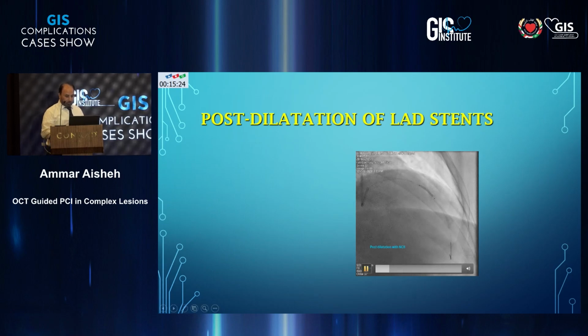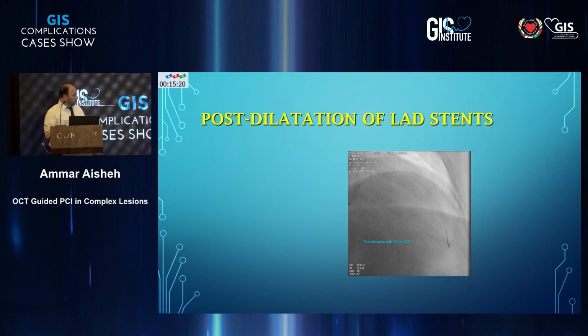So I think that, as Dr. Mohanad mentioned, because the lesion usually is a subtotal occlusion, the contrast doesn't reach the distal area, so you undersize. There is a tip here: you can inject from the side arm during the pullback, so you can get the proper sizing in the distal area. So from the start, the 2.5 was undersizing, in my opinion.